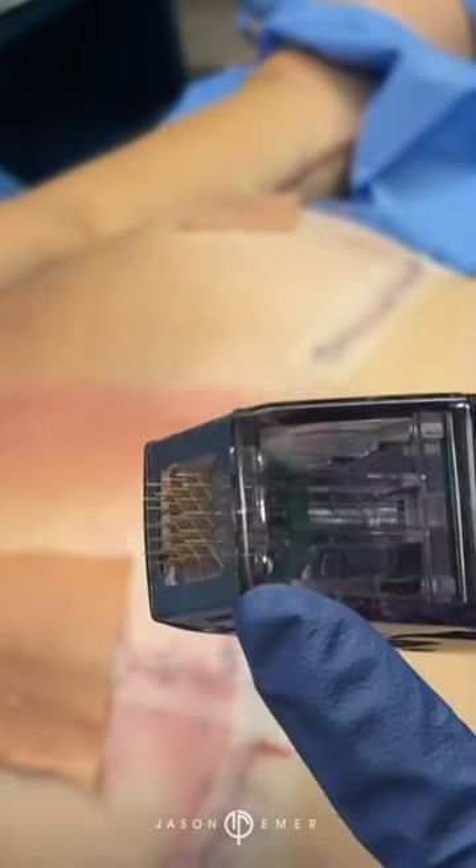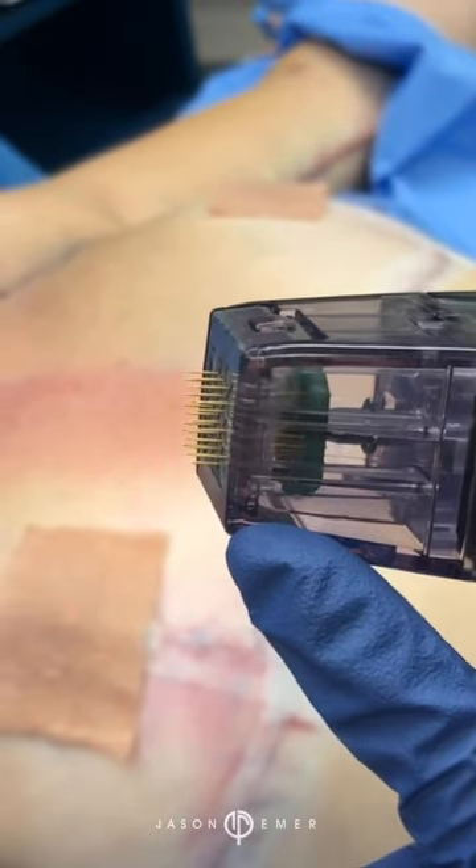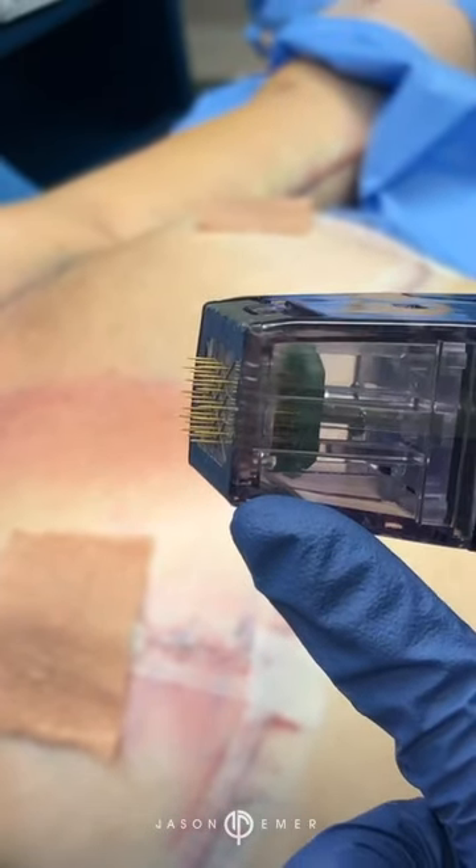That needling is great for textural improvement. You can see it here — this is how long those needles are — so they're penetrating, improving texture, and tightening at the same time.